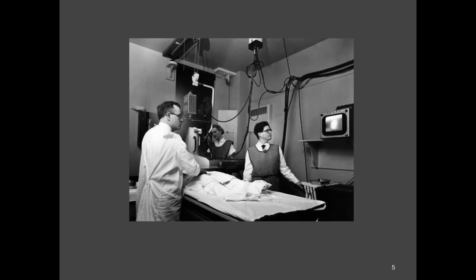So here we have an early lab. We'll just call it that since it doesn't have a specific program. Some of the things that you might notice that are similar to the ones we have now: here we have an image receptor, which in this case is an image intensifier. And then we also have a monitor. I'd have to laugh if you had an interventionalist have to use this site monitor today. Some things that aren't as obvious due to the technology is right up here, this black thing, it's hard to see in the picture.